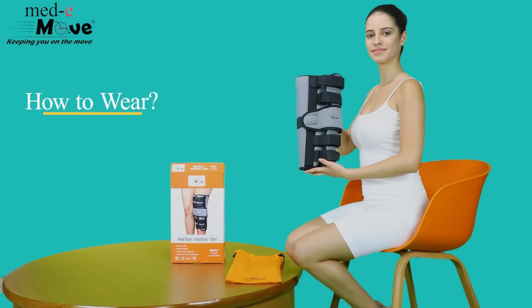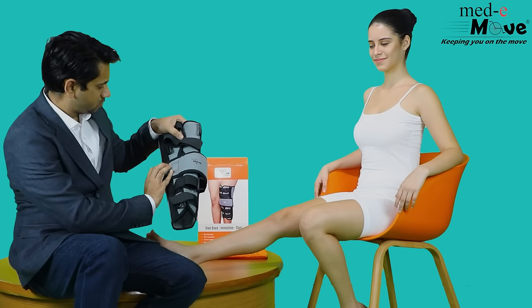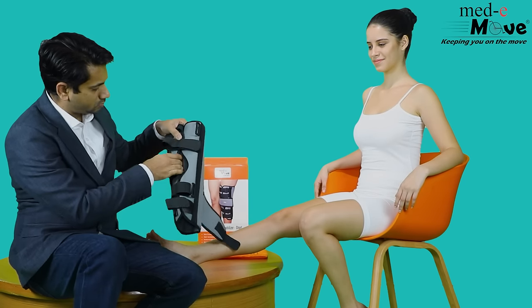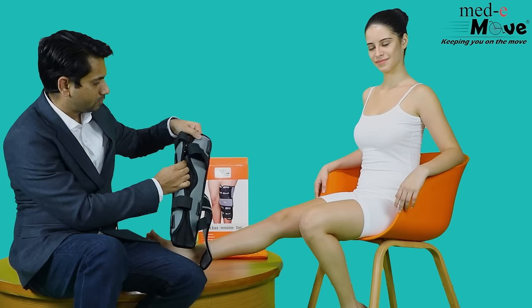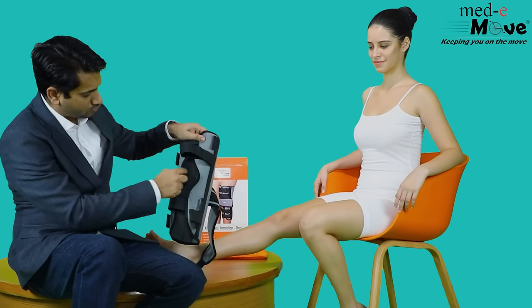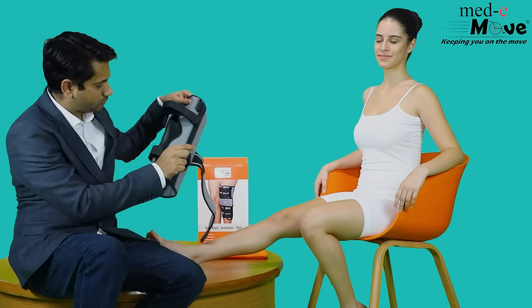Now let us see how to wear the Medimove knee immobilizer short. Unfasten the hook and loop closures. Place the rigid aluminium splints on the side and ensure that the curvature of the knee immobilizer is around the knee.